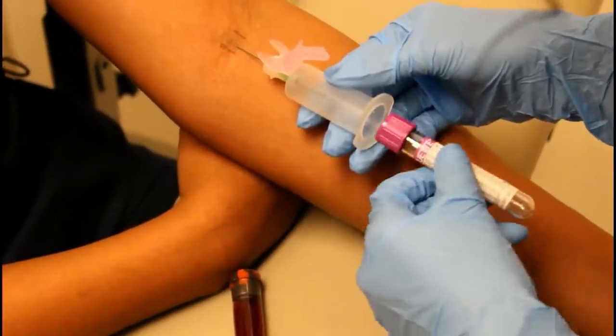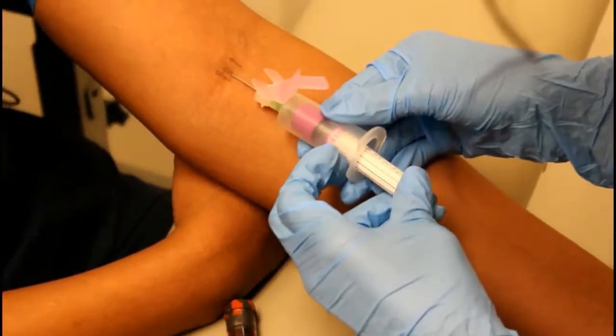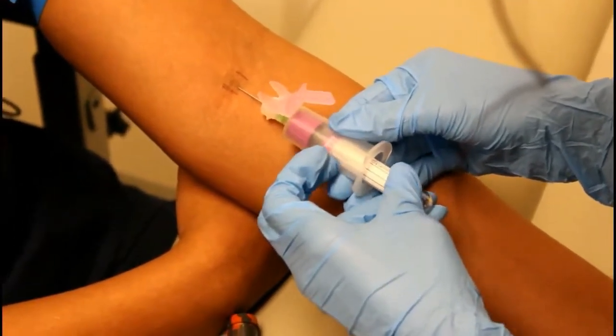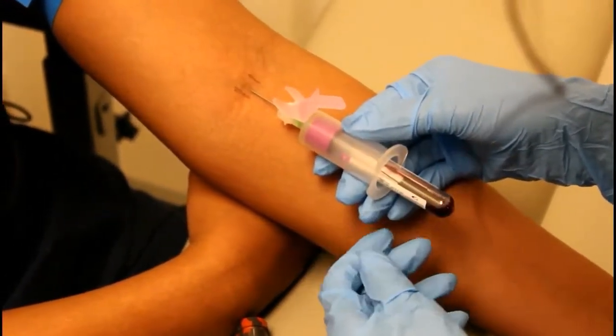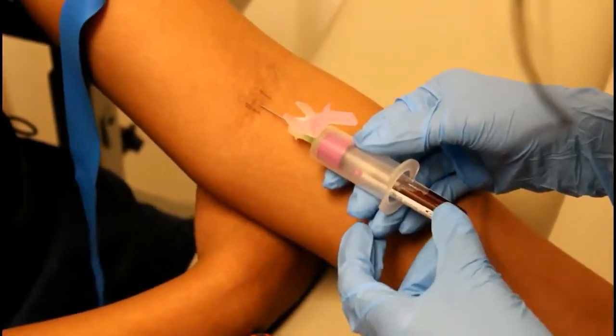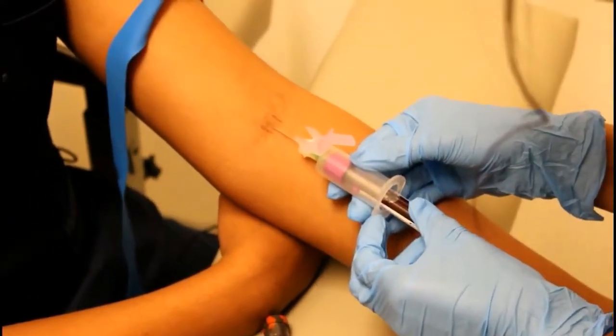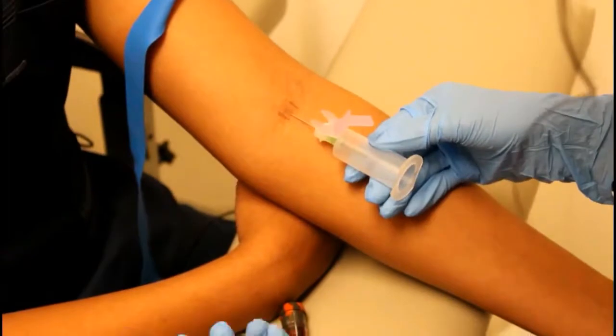When switching tubes without causing the patient discomfort, you want to steady your hand against the arm. Then you can pop the next tube in without pushing the needle any deeper. In the middle of the last tube, remove the tourniquet. Finish and immediately invert the tubes 10 times. Do not shake.